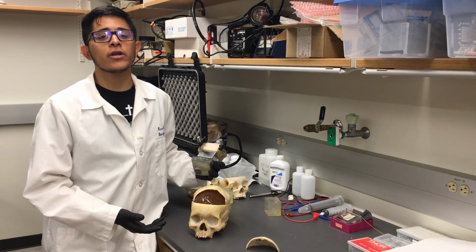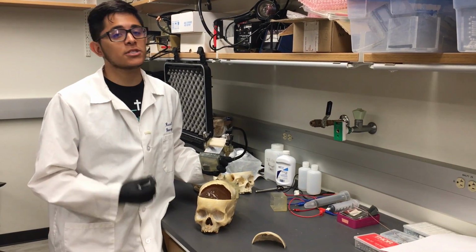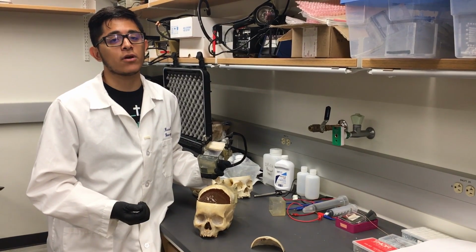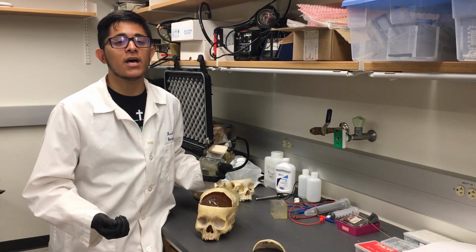I work with transcranial imaging of current densities in the human head model. This is done to determine detection, sensitivity, resolution of deep tissue currents for a non-invasive scenario. I also write software to visualize the four-dimensional images that I am collecting. With the results we gather, we hope to transform our acousto-electric ultrasound technique to a microscale so that we can offer a less expensive alternative to invasive brain activity imaging in the medical device market.